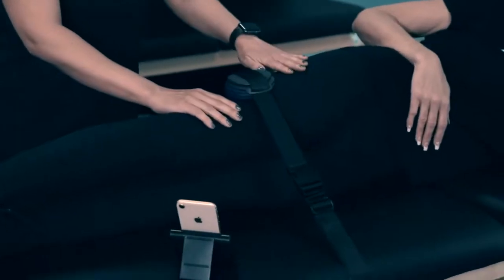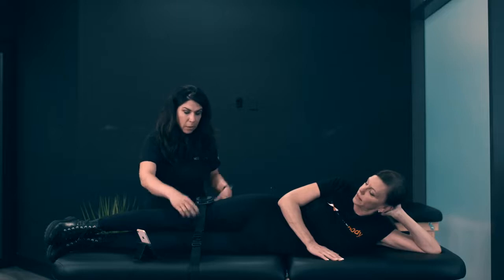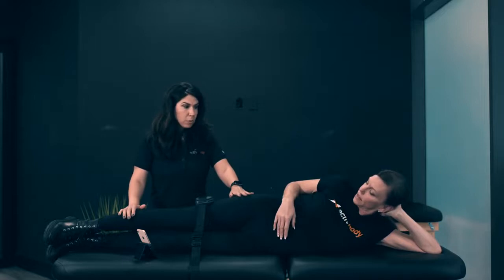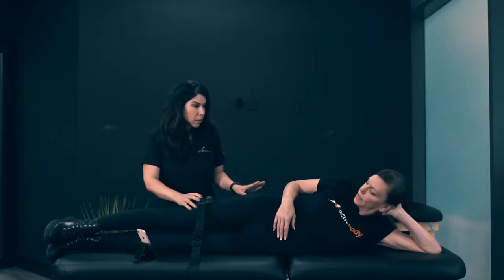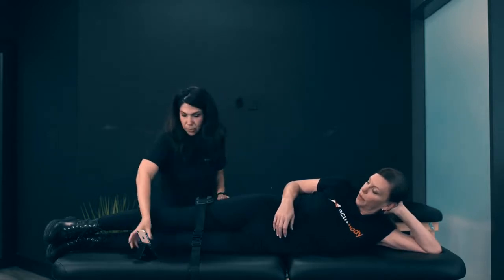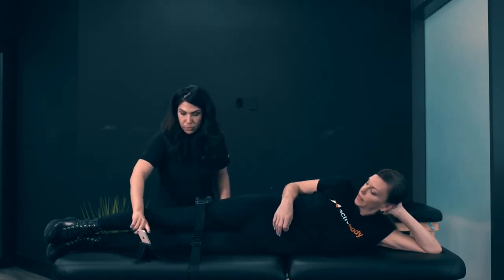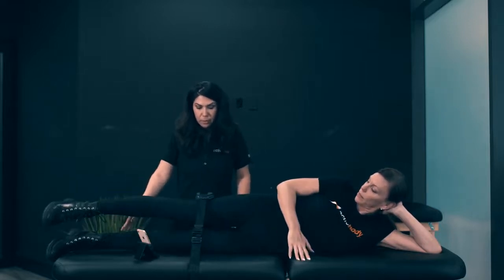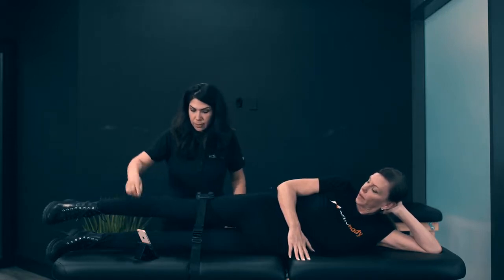We've already attached the ActiveForce pull force belt onto the table. It's fitting tightly against her hip. In order to do hip abduction, I'm going to have her just push up as hard as she can. When you're done, let me know so we can end the test. So we're going to start — I just want you to lift up and hold. And we're good.